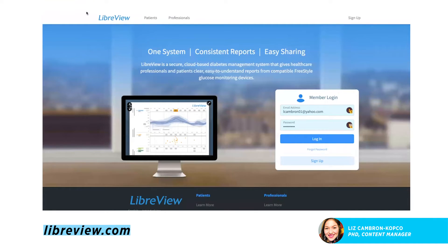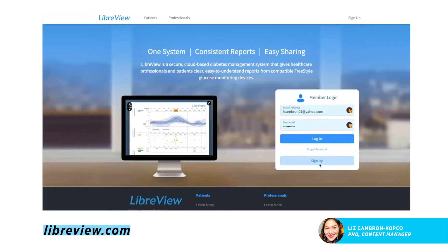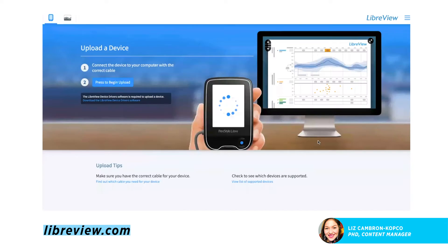You'll go to LibreView.com, and this is the home screen that you'll see. You'll be able to log in. If you don't have an account yet, you can click sign up — it's a very easy process, you just need an email. I already have an account, so I will log in.